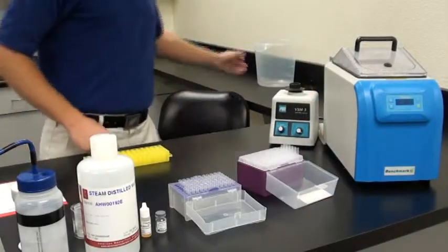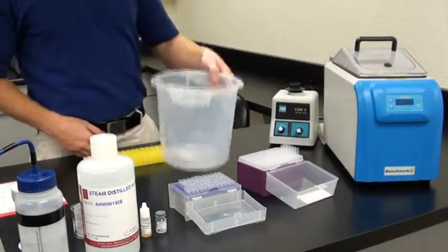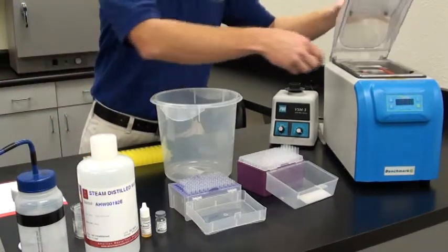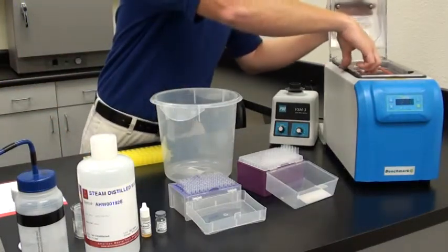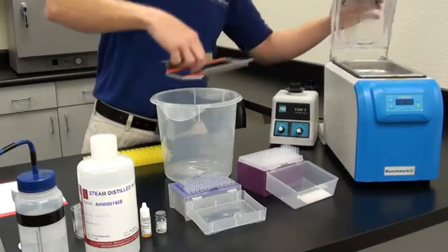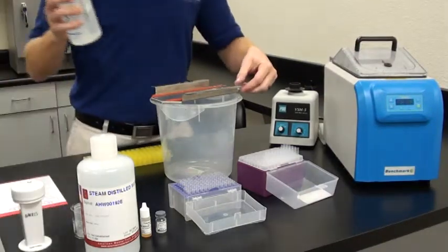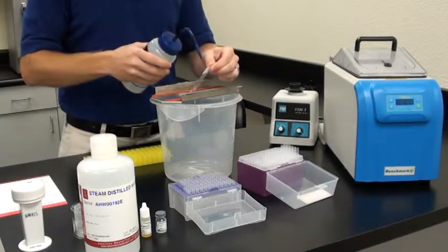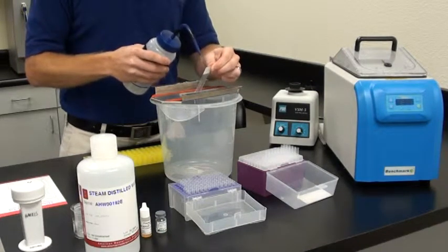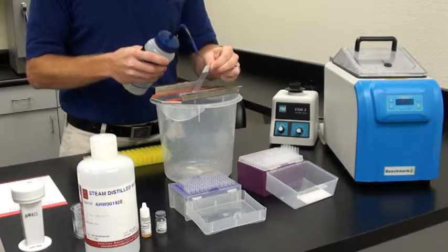Now that 60 minutes have passed, it's time to remove your slides from the humidity chamber or the oven that you've got them in. We want to be fairly quick here in rinsing off the probe and cooling down the slide with the PBS. At no point do we want the slide to dry out.